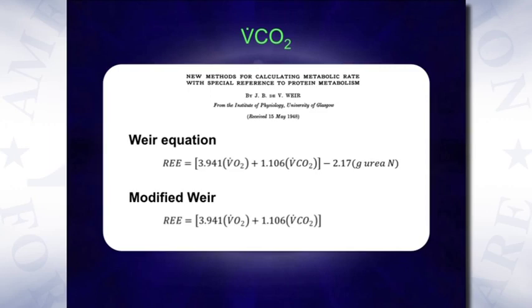So if we forget that and just do the gas exchange monitoring, we can get some important information about how much energy our patients are burning. And our nutrition researchers and dietitians are particularly invested in accurately delivering or prescribing that nutrient that the patient needs.